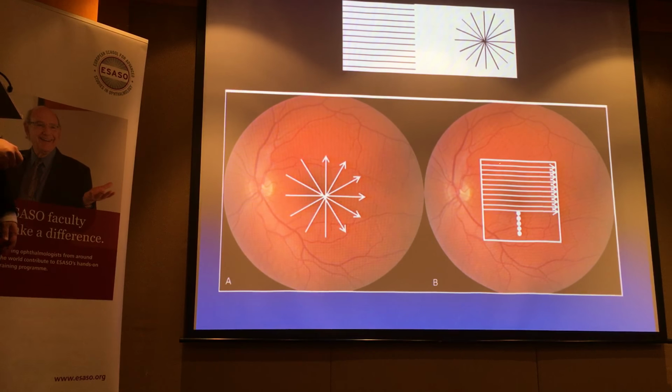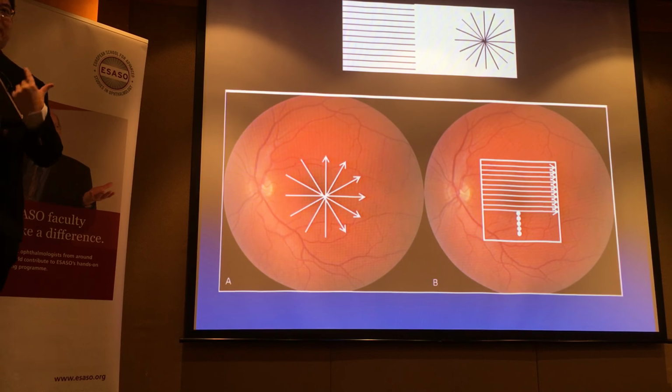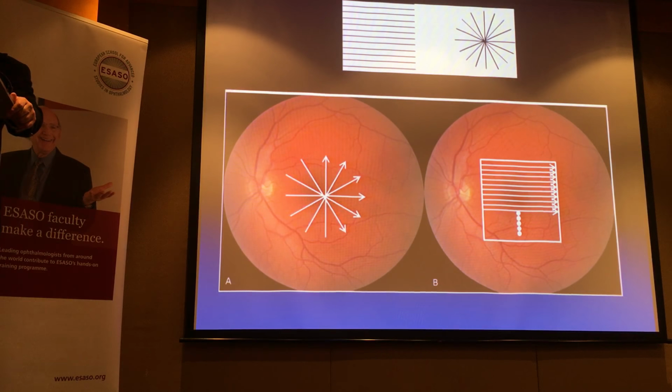And therefore, you need to also be aware of the spacing of the lines, your requirements, and what you need. One caveat again is that I tend to be more fussy with my imaging requirements, or at least I have higher requirements, which sometimes doesn't make me very popular with the imaging department.